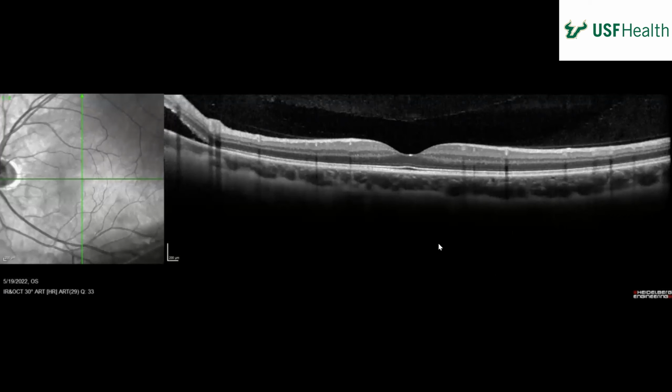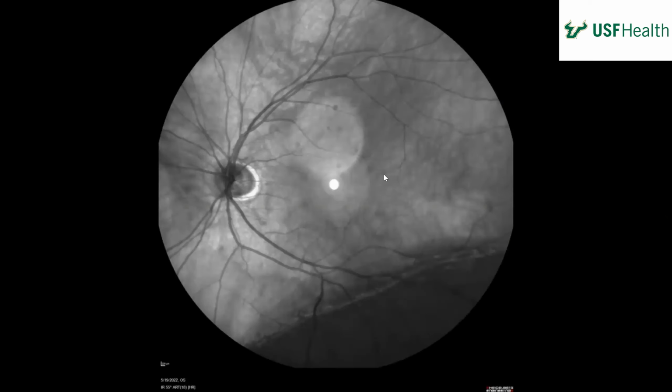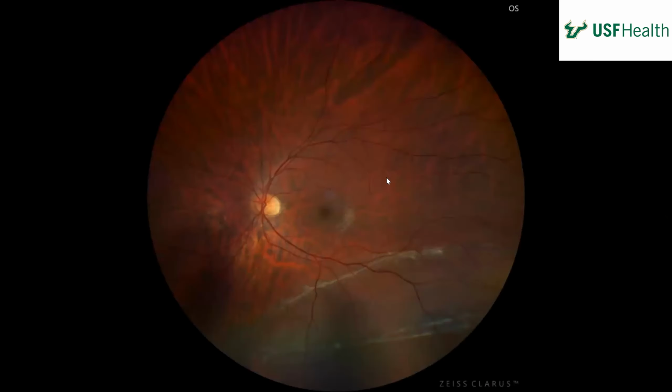Okay, now the OCT image, again left eye. Looks to me like there's good foveal contour. I should go back. Go to the color. What do you think's going on? The detachment here. Good, okay. And what makes you say detachment? Just the nature of the size of this change here, the quality of the discoloration. Yeah, the 3D cues on a 2D image, as Dr. Pavin says.